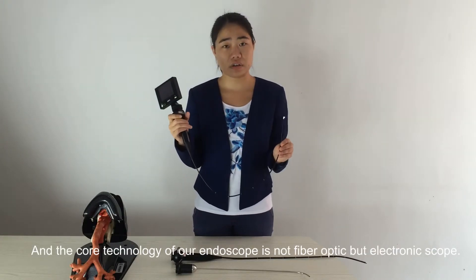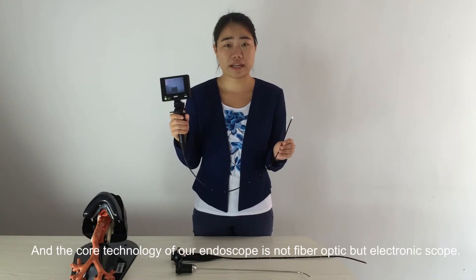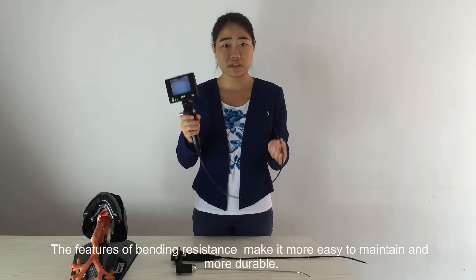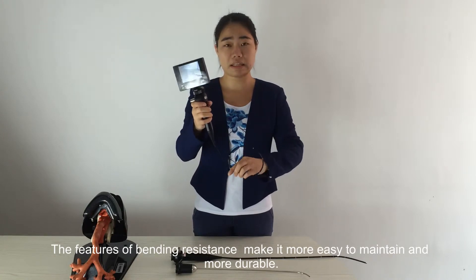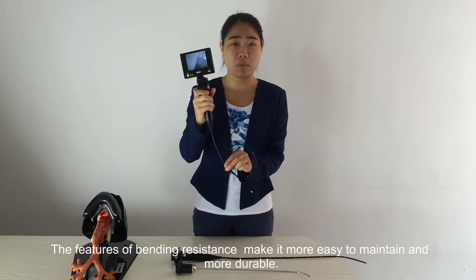The core technology of our endoscope is not fiber optic, but electronic. This electronic bending system makes it easier to maintain and more durable.